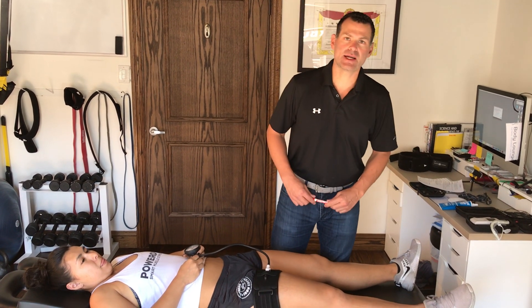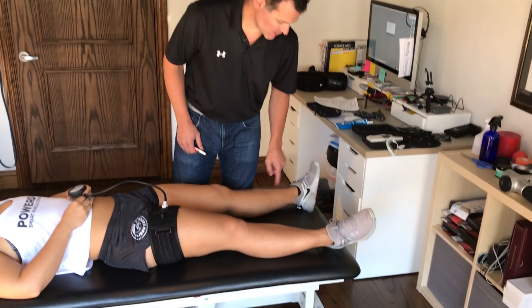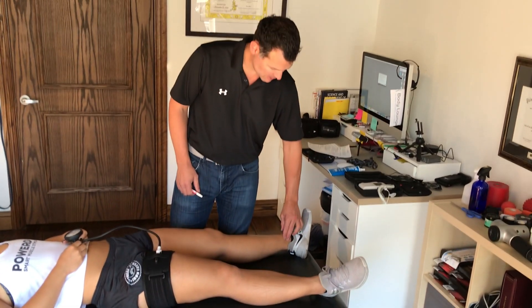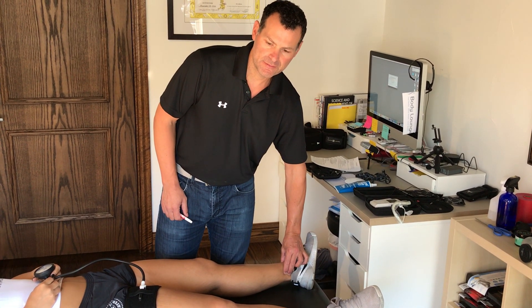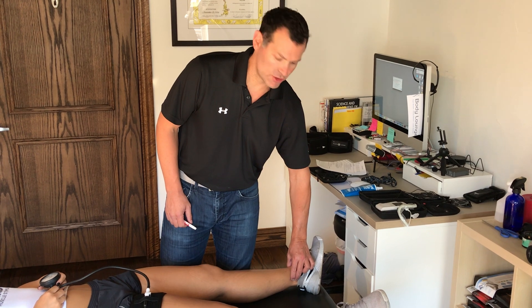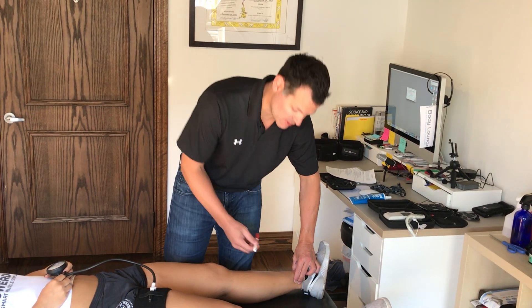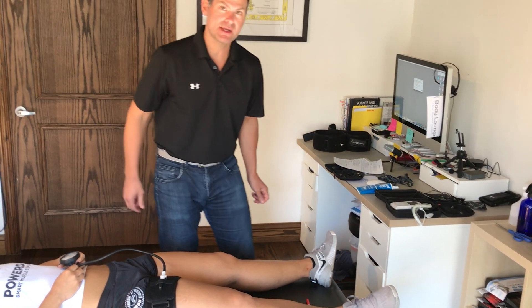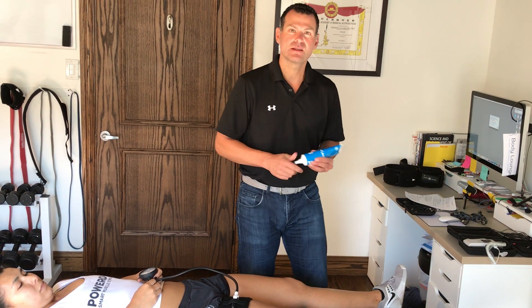Next I'm going to find the tibialis posterior pulse. Right behind the medial malleolus — posterior and a little superior — I should find that pulse; sometimes I've got to dig around a little bit. If needed, I'd have her take her socks and shoes off, but normally I can find it right there. Once I find it with my fingers, I'm going to take a marker and put a little X on it — that's going to help me later on.